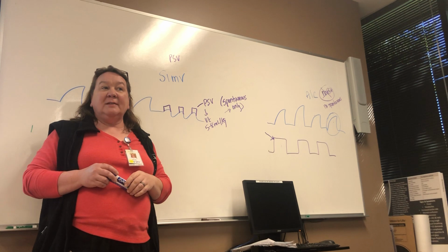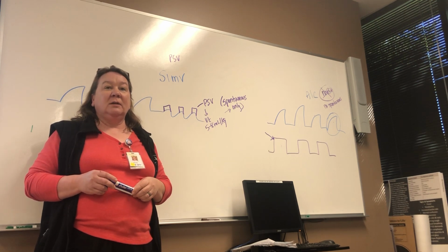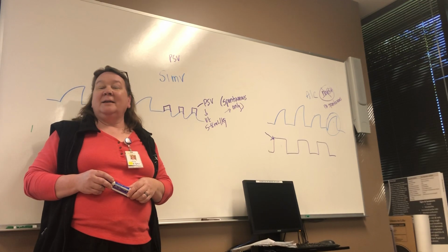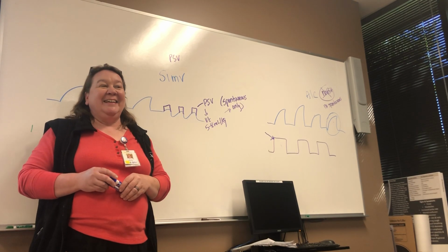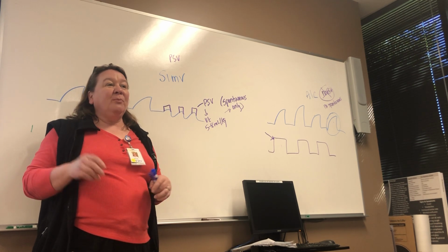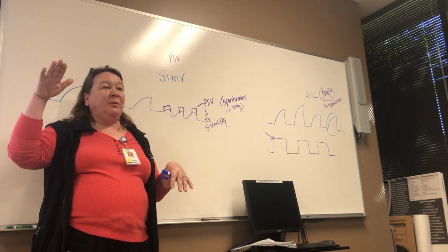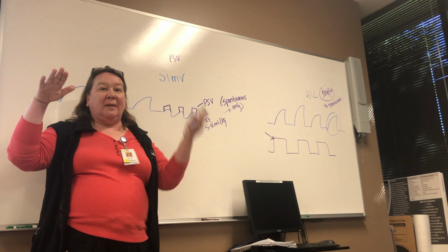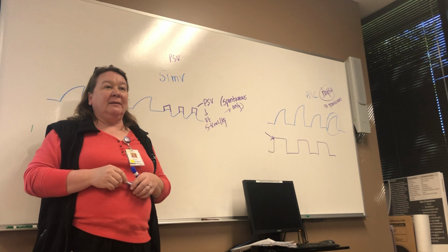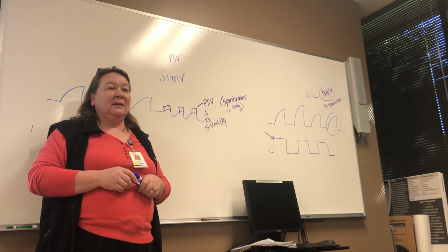And if you're in PRVC, pressure regulated volume control. Set pressure regulated. So you have both, kind of. Pressure regulated volume control. So in PRVC, you set the max pressure and it will adjust to get the volume that you want.